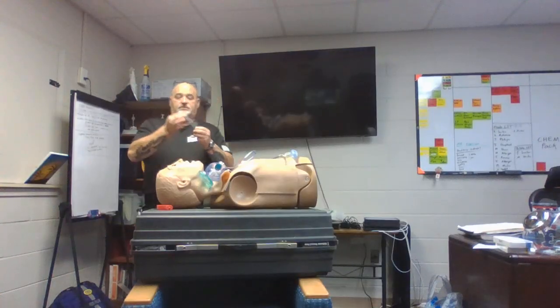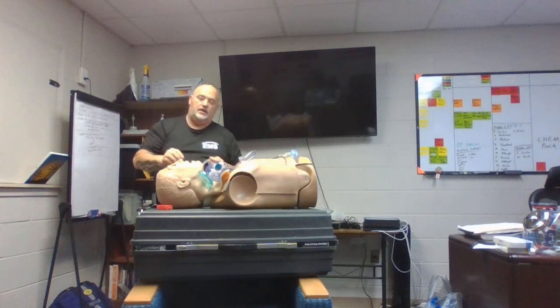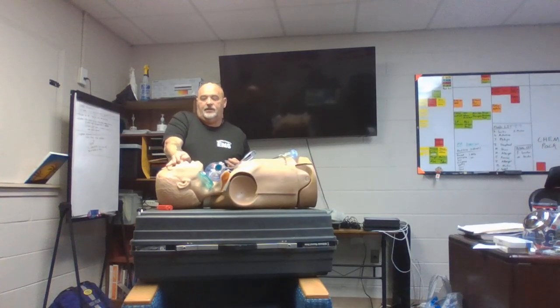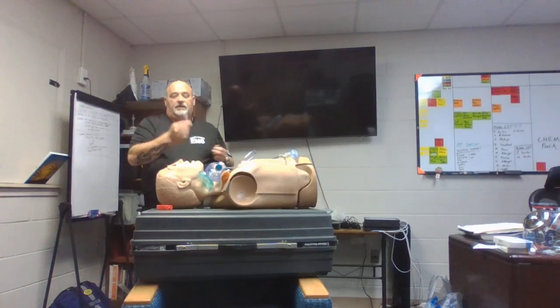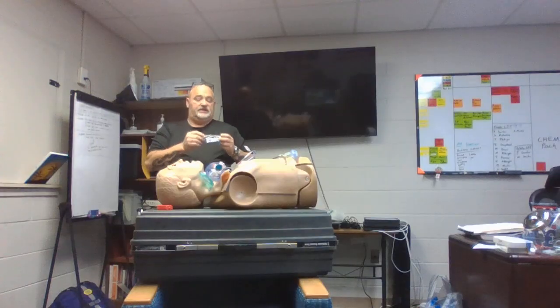NPAs, nasals, right? Remember, I said this mannequin was extremely difficult. I'm not sure what's going on with his nose. There's like hard plastic things in there. This is an airway mannequin. You would think it would be much easier to put a trumpet in. But I struggled probably 30 minutes before I started to make this video.